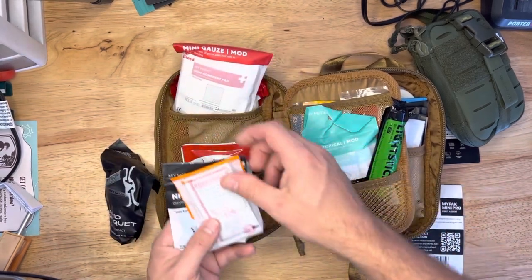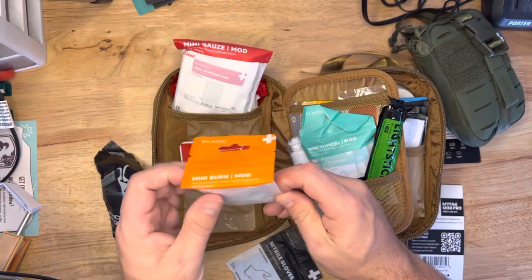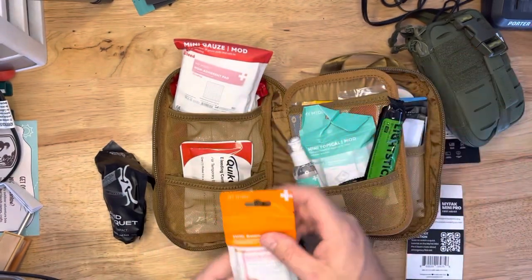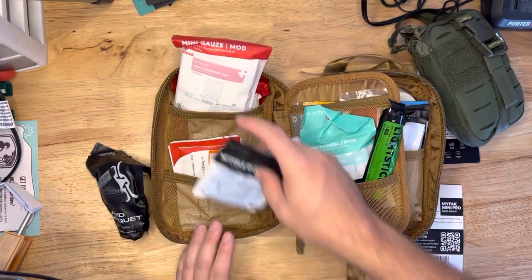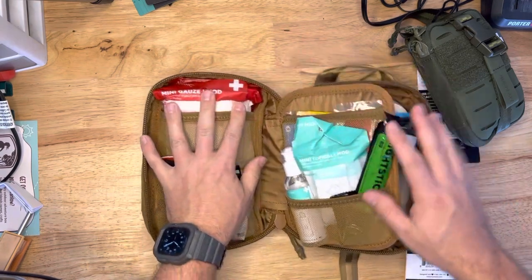I would prefer a CAT tourniquet, if that's okay. Burn shield, nitrile gloves. These little burn things are awesome — this is one of their burn mods, mini burn mod actually. What I love about MyMedic is how well they organize their kits. When you open this, you're not like 'what the heck is everything?' It's all labeled. If you don't know first aid or don't know what you're looking for, you could still be useful in a situation because you can easily see things that are labeled. Dig that. So you've got bleeding and burn over here.